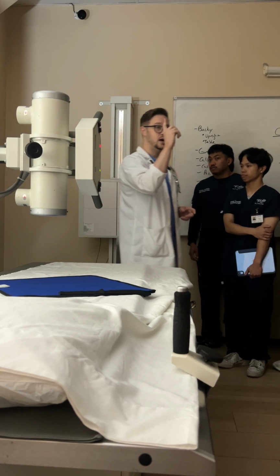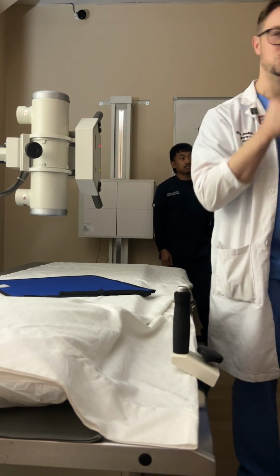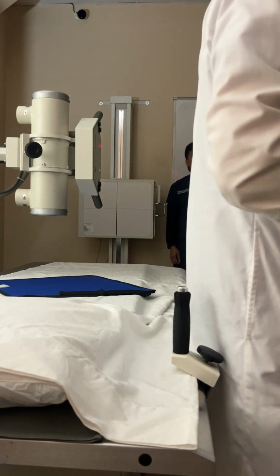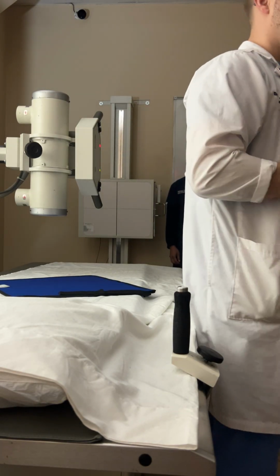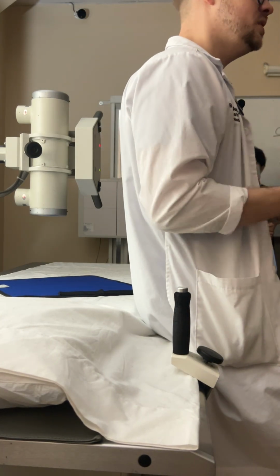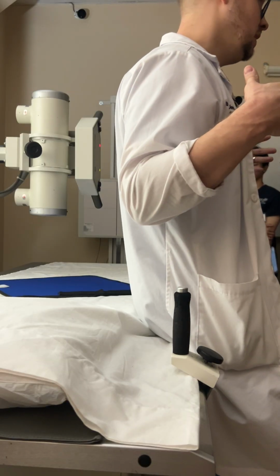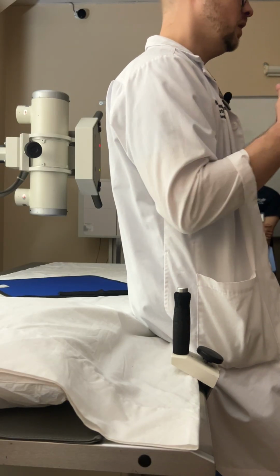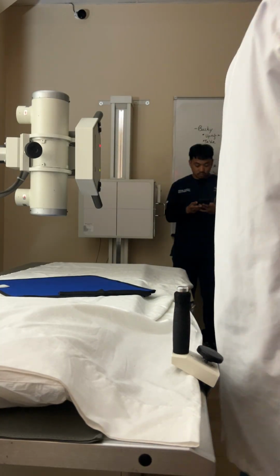Okay, help me with your name. I'm so sorry, I'm going to get it eventually. Victoria. Victoria, I would probably have my cassette portrait. Okay, if it's someone who is larger body habitus, not necessarily obese, right? Then I might have the cassette crosswise because I know that their lungs are not going to be as long. They're going to be wider and broader at the base, right?